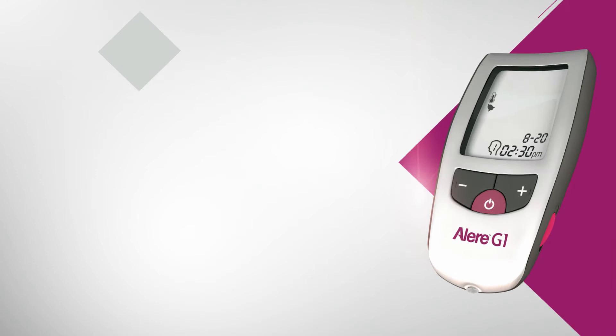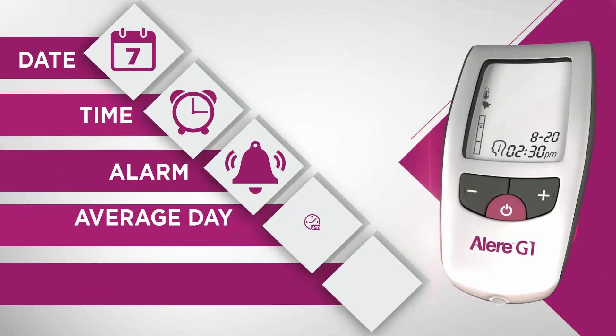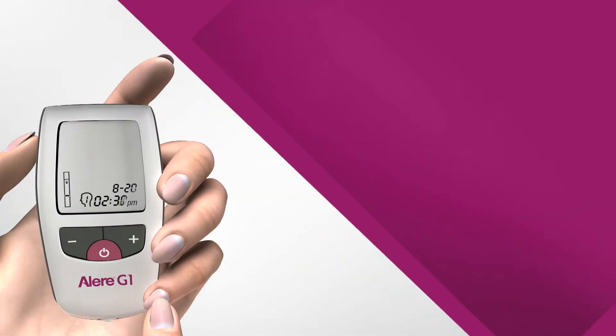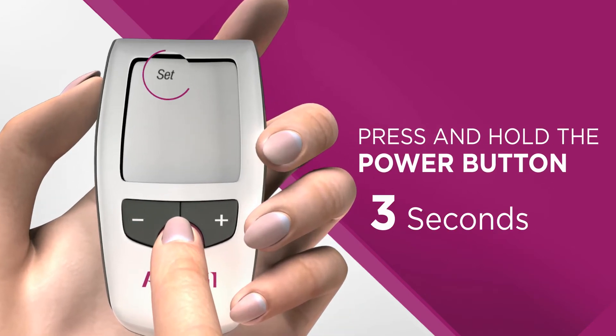Your Alere G1 meter comes with an option to preset your date, time, alarm, average day, and unit of measurements, and so on. To set these, press the power button and hold for about three seconds till the 'Set' option flashes on the screen. Release the button to enter the mode.